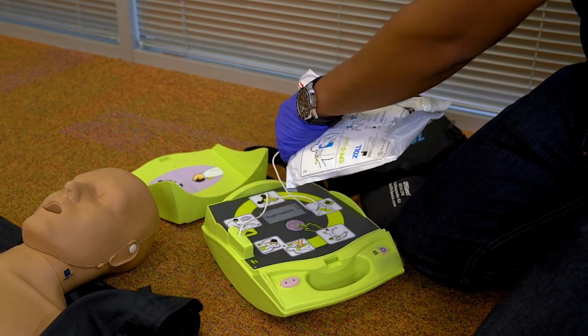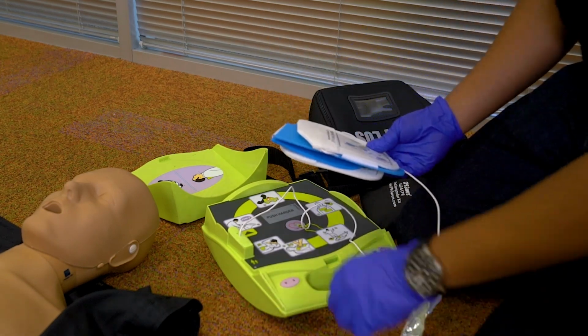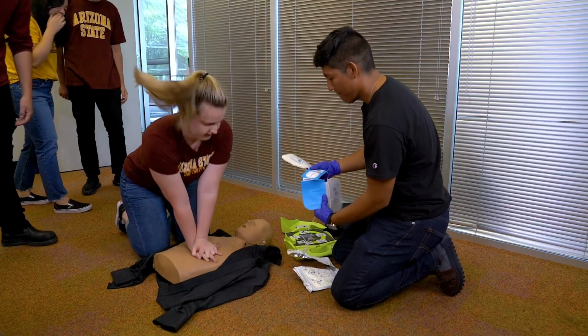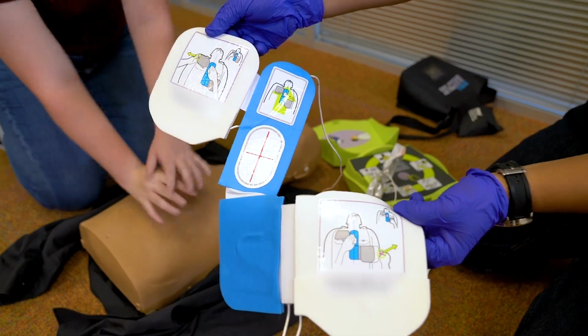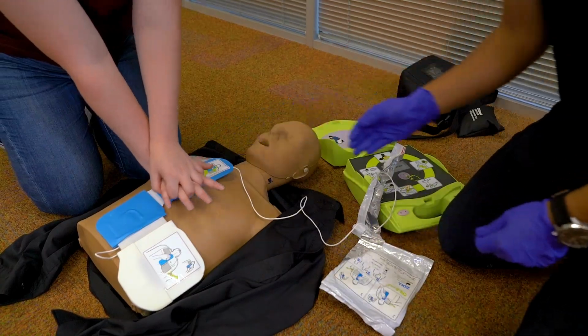Attach the AED pads and plug in the connector if necessary. At ASU, all AED pads should have the connectors already plugged in. Follow the instructions on the AED pads for proper pad placement. Place pads around or under any non-removable obstructions, such as a pacemaker.